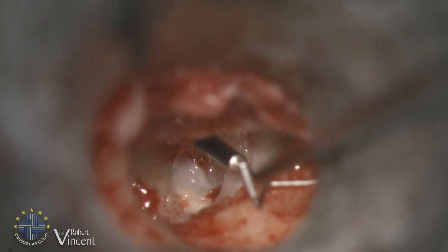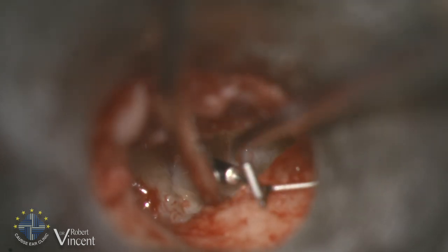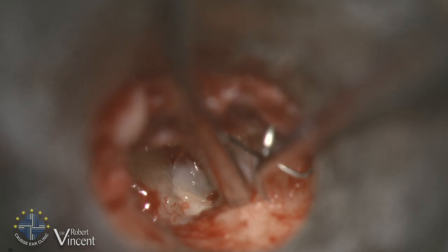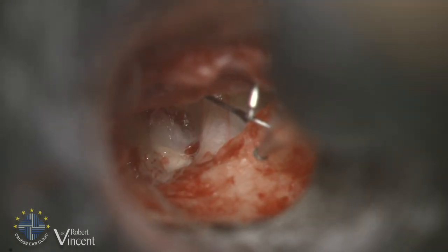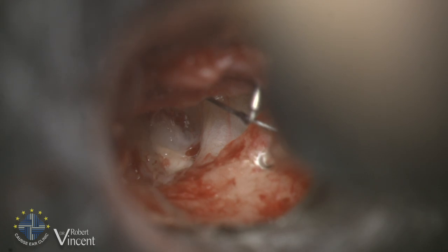I have to think about the position of this malleus prosthesis according to the lateralized tympanic membrane. If I place it too close to the bone it would not be good enough — I have to put it a little bit up. I will make the first hole here and then decide for the second one. Note the white shape of the prosthesis — this white shape gives the flexibility of the prosthesis, so even if you have bony regrowth, the mobility of the prosthesis is still maintained.